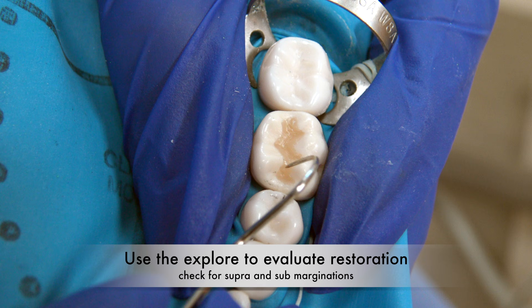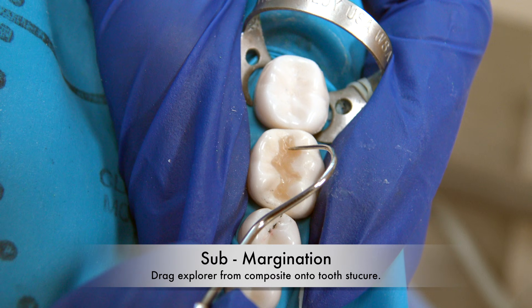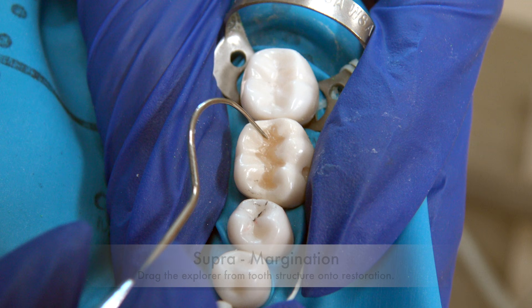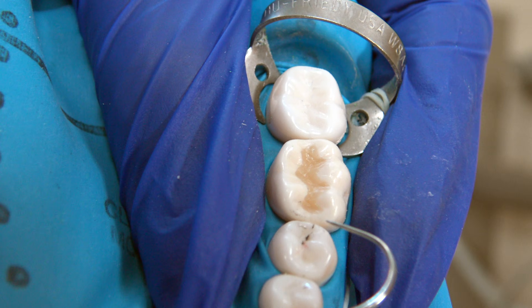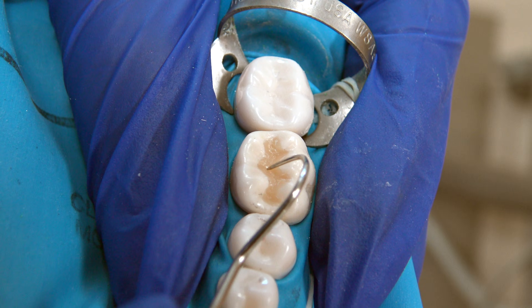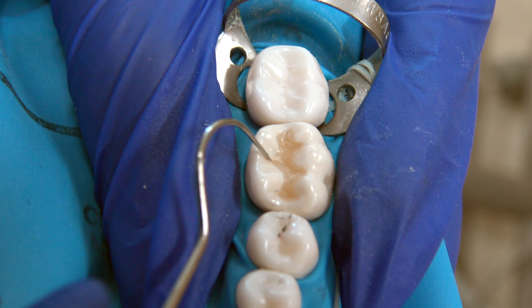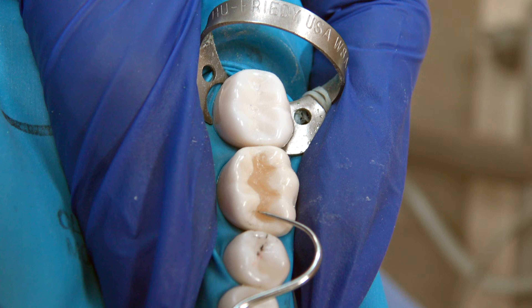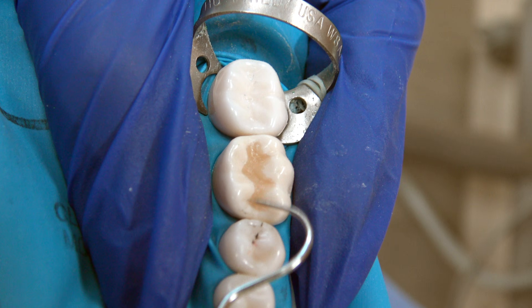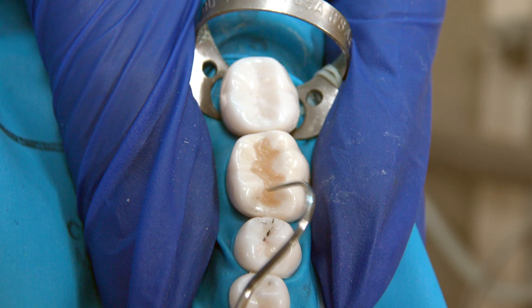Use an explorer to confirm the anatomy. Confirm that your margins are not supra-marginated or sub-marginated. You want to make sure that you're following the proper slopes and valleys and that you have your central groove in the right place. Confirm that you've maintained the anatomy of the fossa and the oblique ridges.